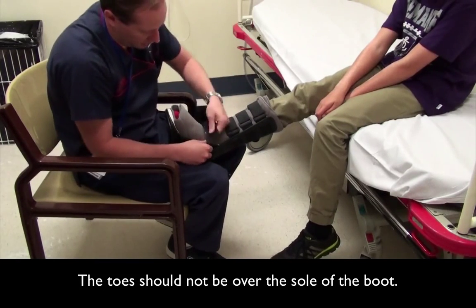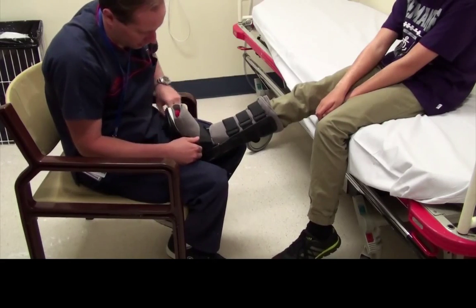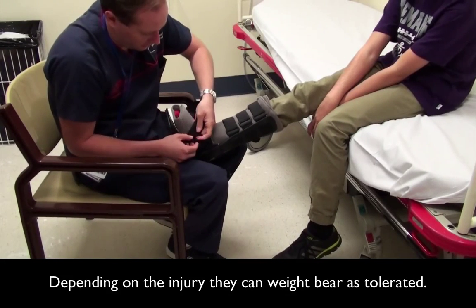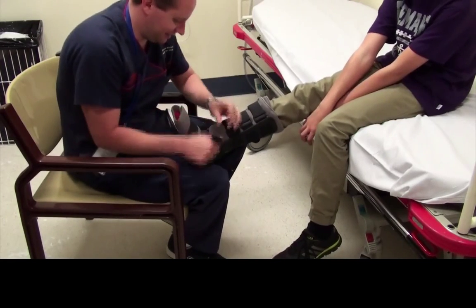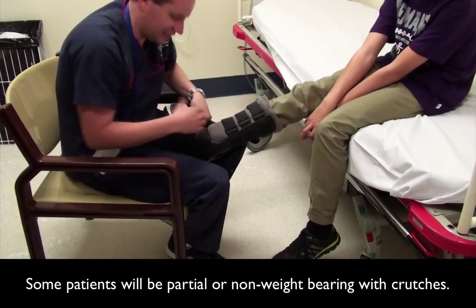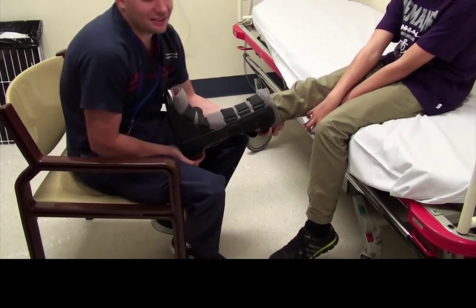Ensure the toes are behind the firm sole of the boot. Depending on the injury: weight bear as tolerated, partial weight bear with crutches, or non-weight bearing with crutches.